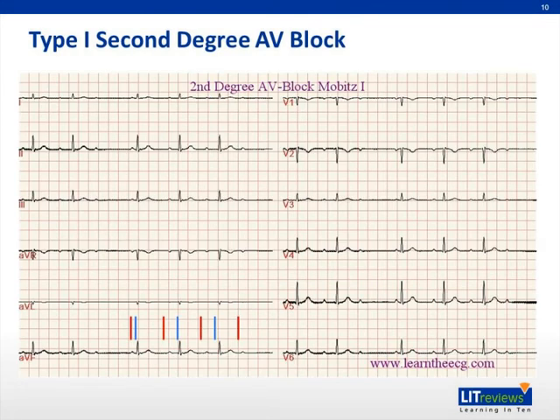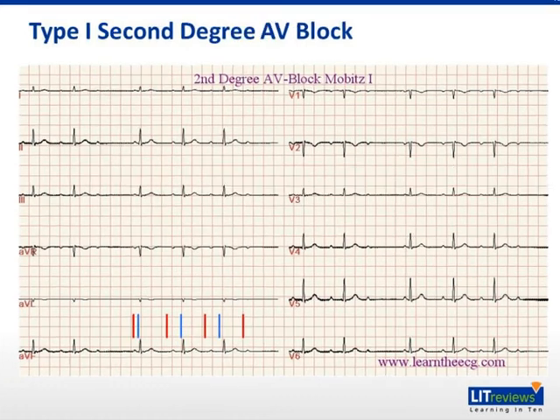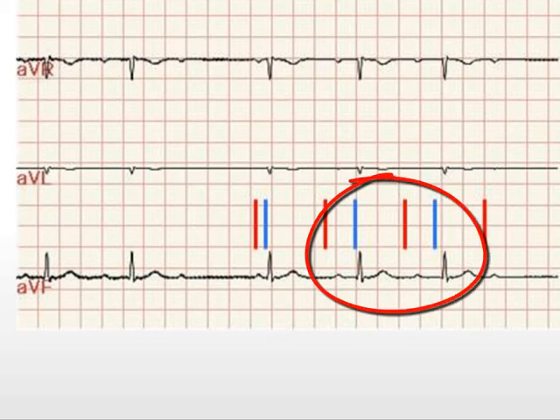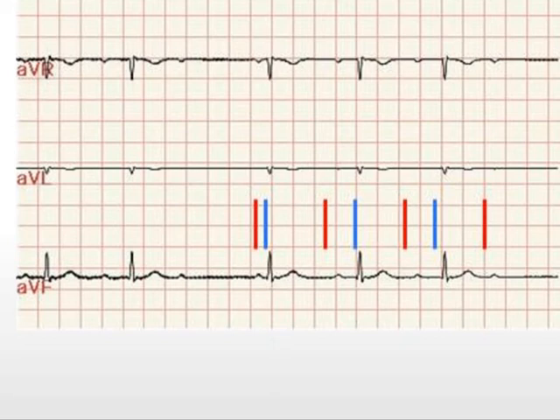This is a 12-lead ECG of a patient with type 1 second-degree atrioventricular block. Starting with the third beat in lead AVF, you can appreciate a normal PR interval. However, the fourth and fifth beats show a progressively prolonging PR interval with ultimate dropping of the sixth atrial beat. Vertical red lines depict the onset of P waves and blue lines depict the onset of the QRS. The increasing distance between red and blue lines shows PR prolongation, the shortening distance between blue lines shows RR shortening, and ultimately no QRS is conducted — confirming all three diagnostic criteria.